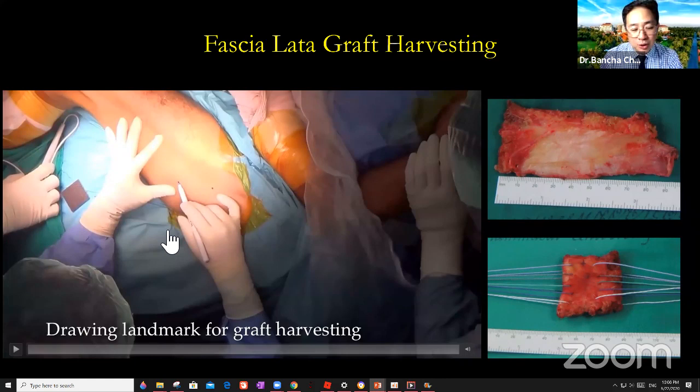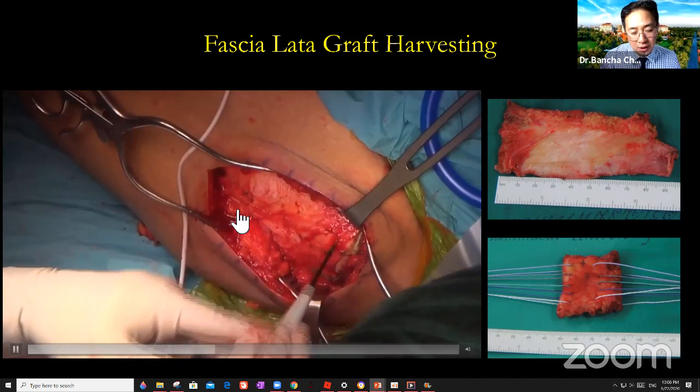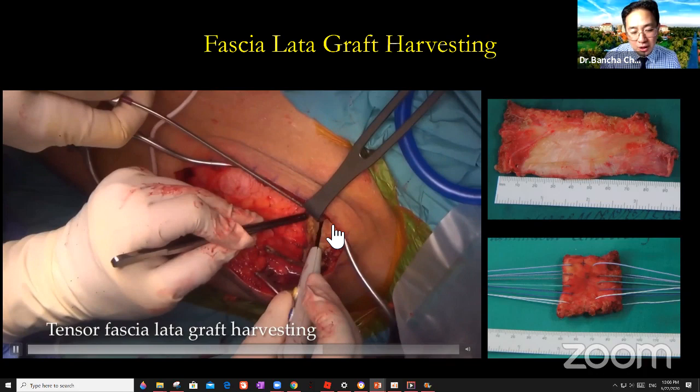So first we harvest the fascia lata, okay? You do flexion, adduction, internal rotation, okay? And you identify the tip of the trochanter, okay? And then another team is to prepare the graft.